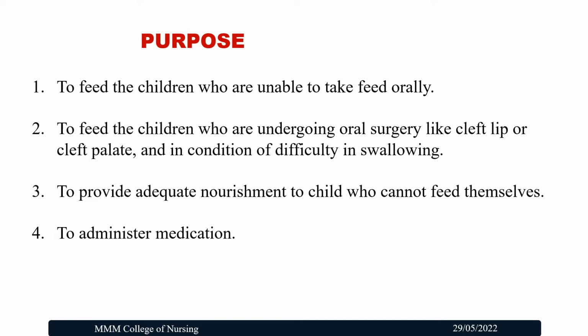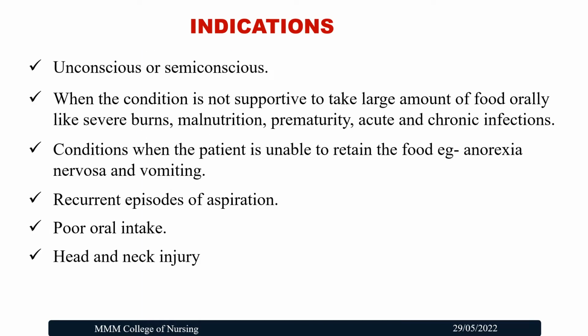It is used to feed children who are unable to take feed orally, and also to feed children who are undergoing oral surgery like cleft lip, cleft palate, and conditions of difficulty in swallowing, etc. It also provides adequate nourishment to a child who cannot feed themselves, and is used to administer medication. Next, the indications.